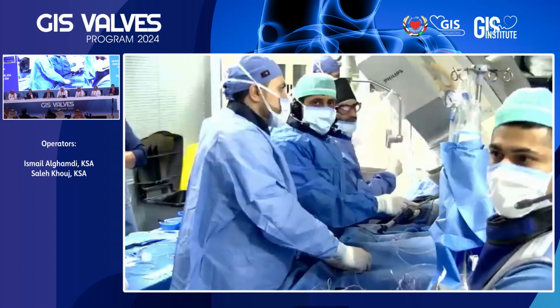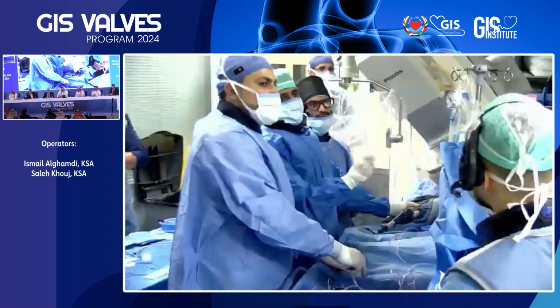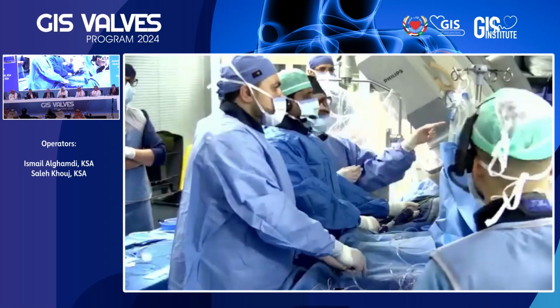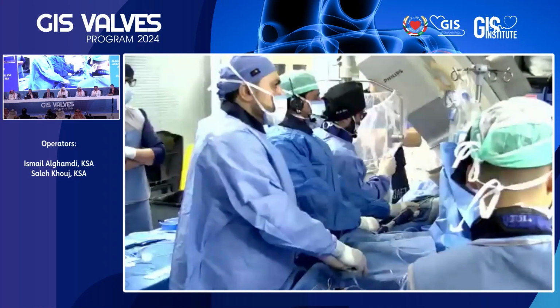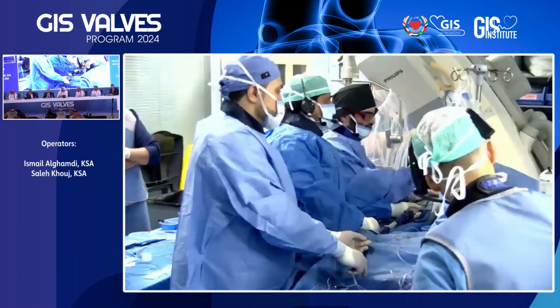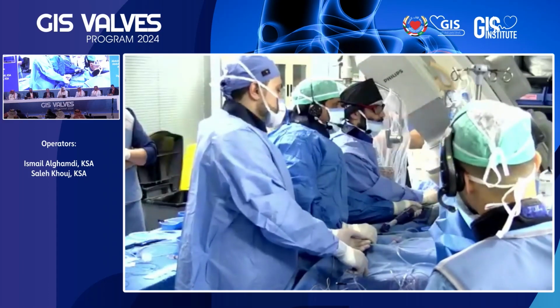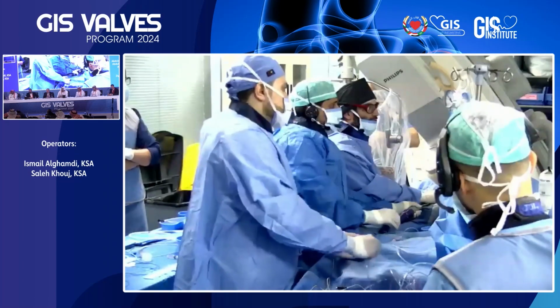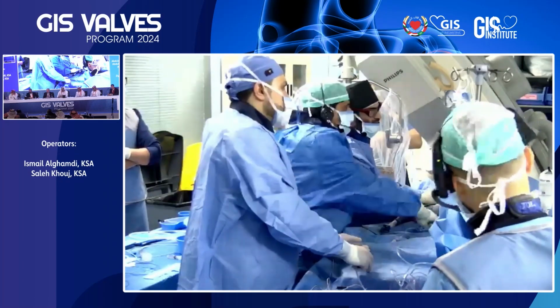I see that you started deploying. If you can, take us through the views during your deployment, Ziad, if you are at a moment where you can share it and hemodynamically stable. Are you fully deployed or not yet? No, at 80%, not yet. Okay, we would love to see the fluoro screen, Dr. Saleh. Do you see the screen now? No, we didn't see it.